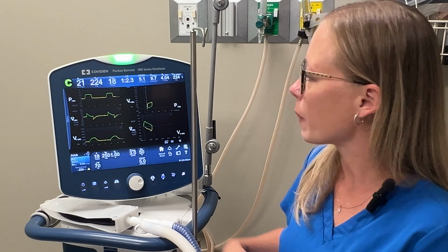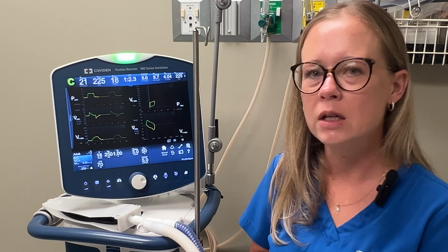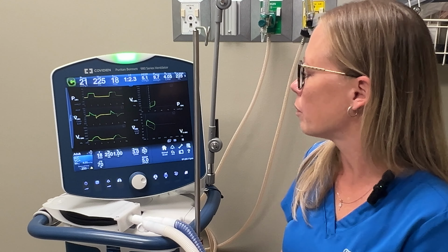We're kind of just seeing where they're at. That spontaneous mode means that the patient is doing all of the work. We are just providing a little bit of support on our end with the ventilator to help them breathe past that ET tube, to help them breathe past that airway.